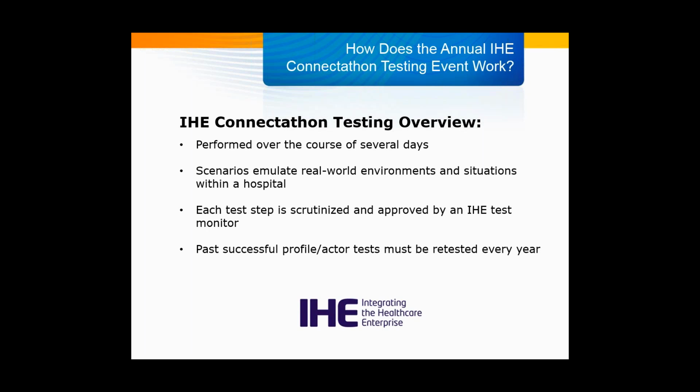And again, there are some rigorous test tools that help with all the validation. And there are many different kinds of integration testing going on, from things like security to performance to network and error handling. For example, we might do a test where we disconnect the Ethernet and see if the device can actually get reestablished and start communicating again. So there's a slew of those.